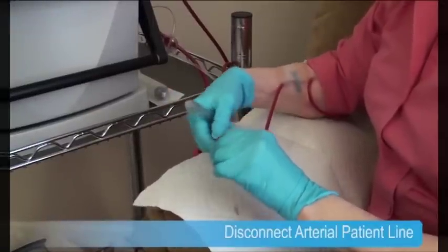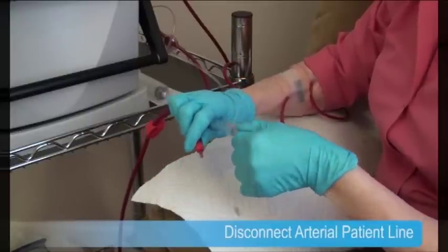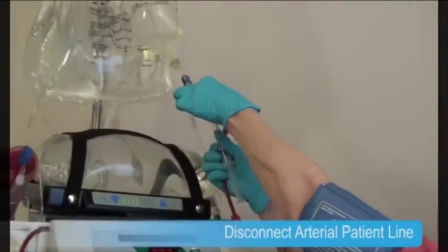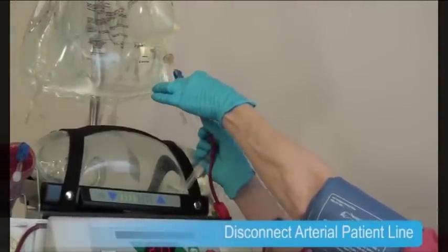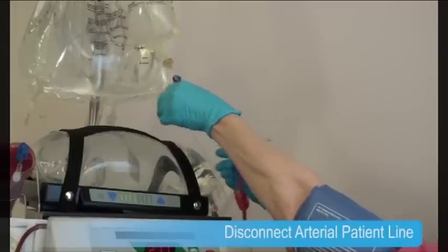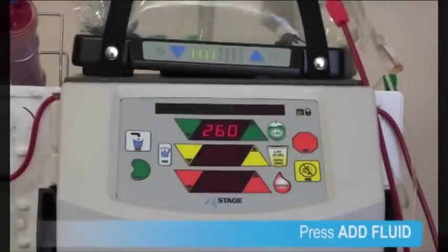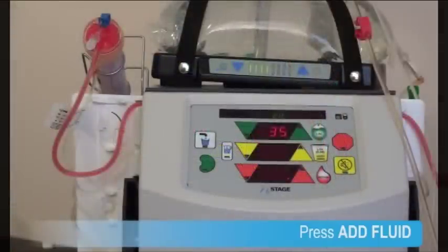She places one of the syringes from the saline spike on the arterial needle line. Now she connects the arterial patient line to the priming spike and unclamps the line. Next, she completes rinse back by pressing Add Fluid on the cycler. When the cycler counts down to zero, she double-checks her lines to make sure they're clear of blood.